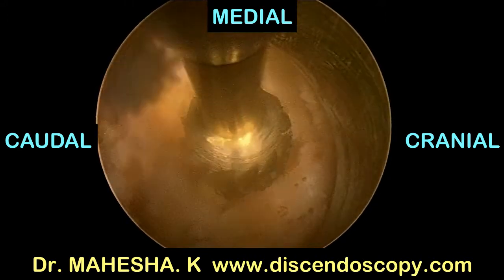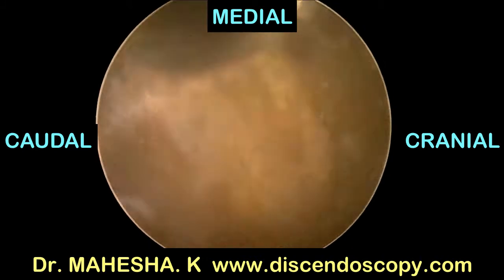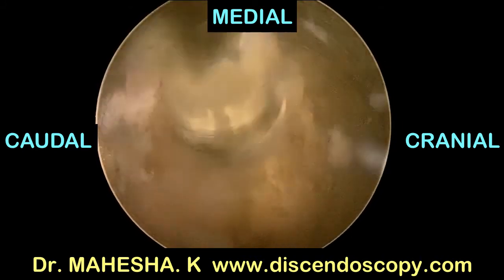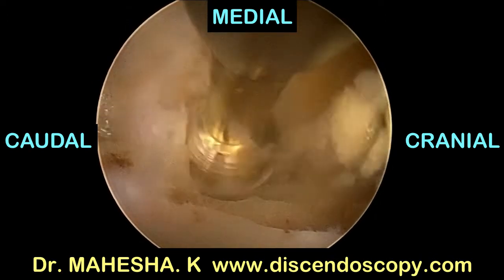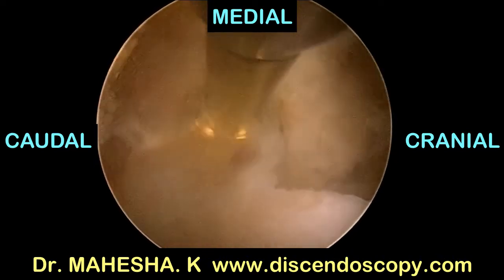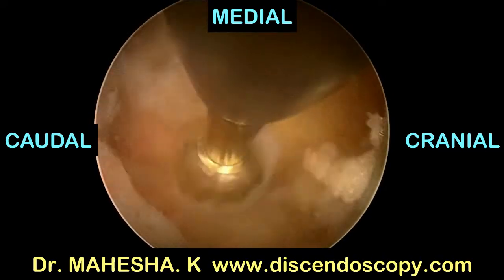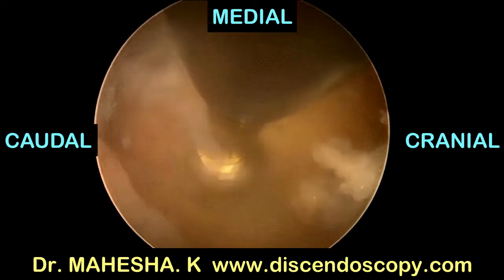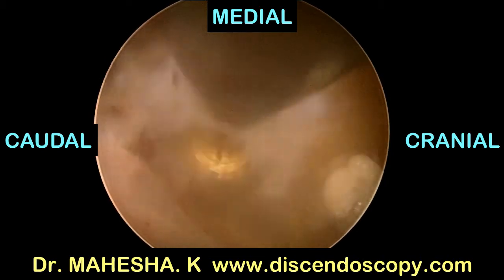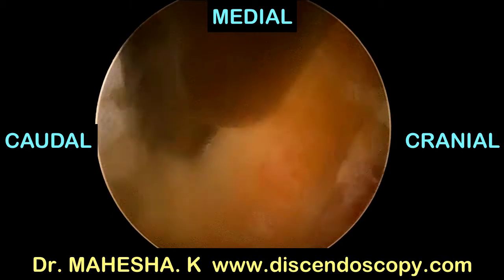A 5 mm bur is being used to do laminotomy. In a degenerative lysthesis, the laminotomy will be very conservative with the facet resection. Too much facet resection will exaggerate the instability and can cause problems. Facet resection has to be very conservative.